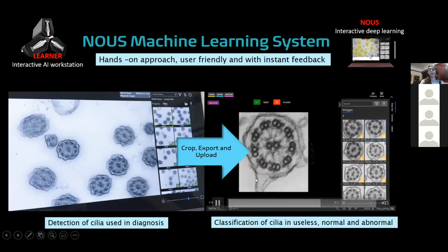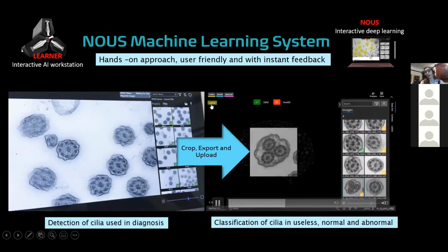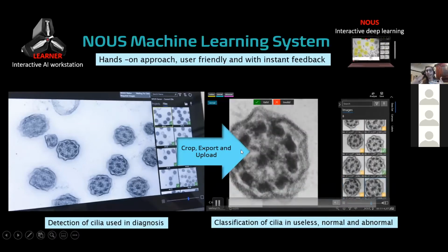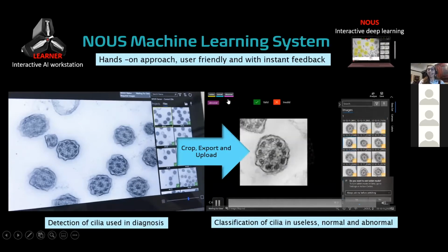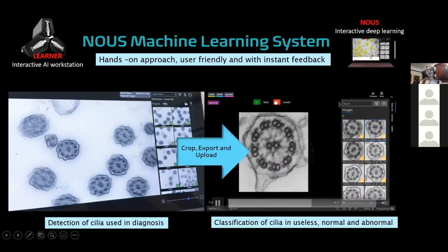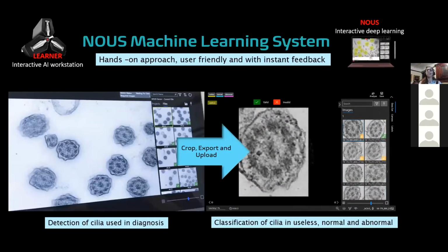And what you see here going through, if you look at the corner, you see a little label appearing. The pink is abnormal, blue is normal, and yellow is useless. This is just streaming in a circuit, all just running, but you can see that it's already giving some predictions after the training, and it has here valid, invalid. It's allowing me to validate its suggestions, its guesses. This is how we do the training, this is how we do the validation.